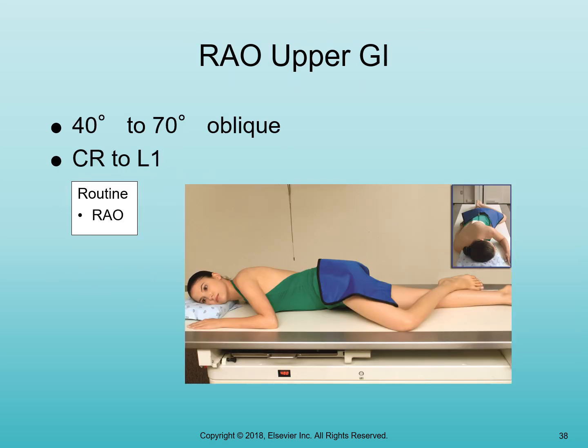After that, the patient would roll into an RAO, and that is on page 494. All right, RAO is the third position. Still at a 40-inch SID, still collimated to a 10 by 12 portrait, still using left marker. I'll tell you this, so on the AP, it's left marker, it's down.